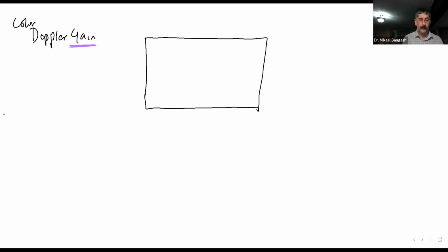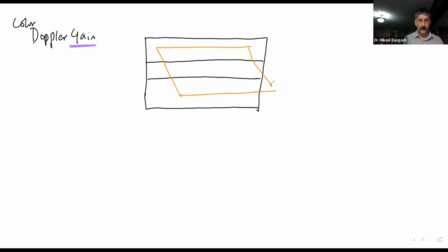Now let's take it the simple way. Let's say we had a blood vessel, and that we had steered our angle to an optimal angle, anything but 90 degrees. Did you guys get that?